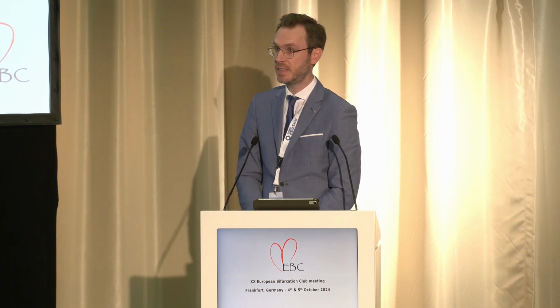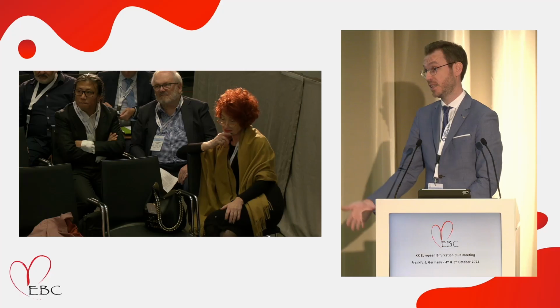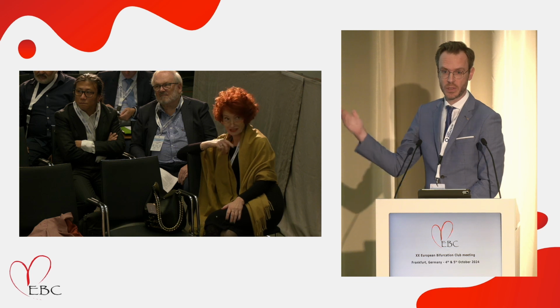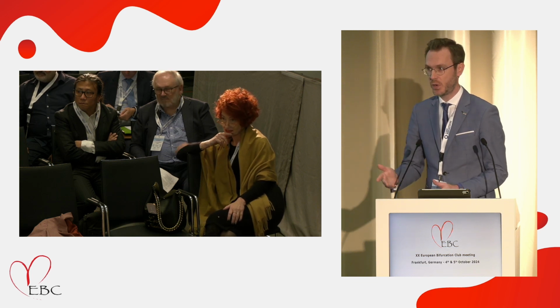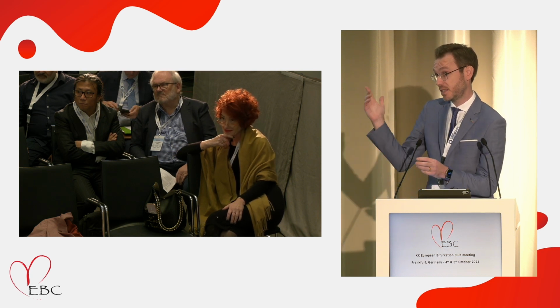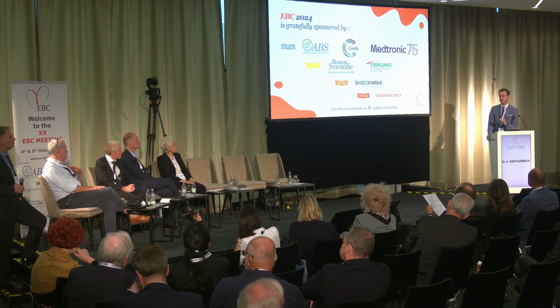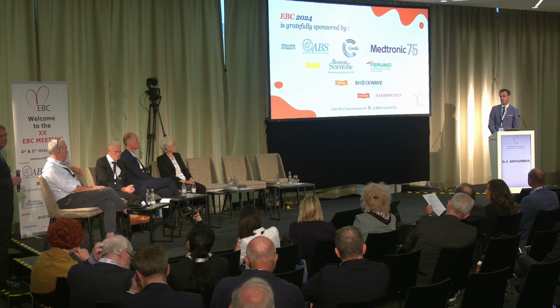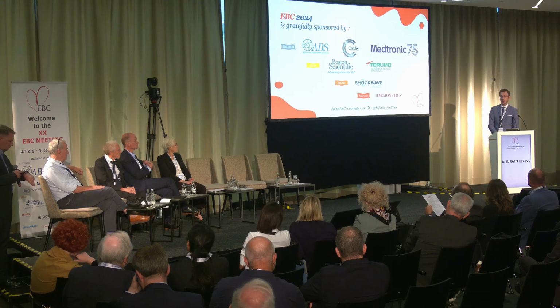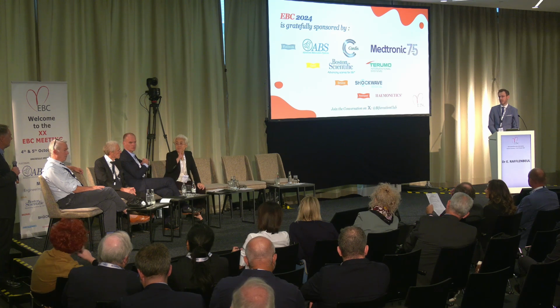He had stable platelets. But we know cardio-oncology patients are worse treated, like females are undertreated, and patients with carcinoma are undertreated everywhere around the world. So this is what the decision was made in the first index procedure 3 months before, to do nothing, leave nothing behind, but you could at least say do physiology and see if the patient needs treatment, or you can put him on optimal medical therapy, which he was on. He had HFrEF, he was on bisoprolol 10 milligrams and all other things, Magic 4, and still having chest pain.